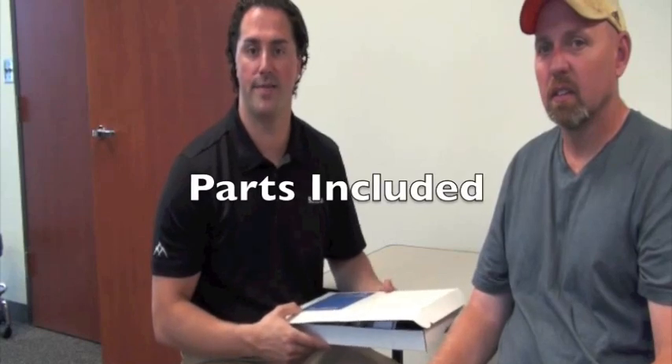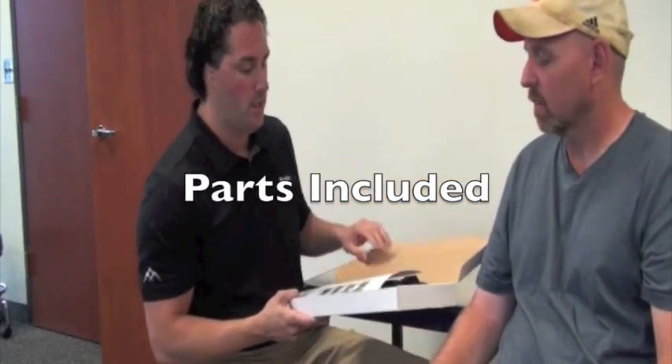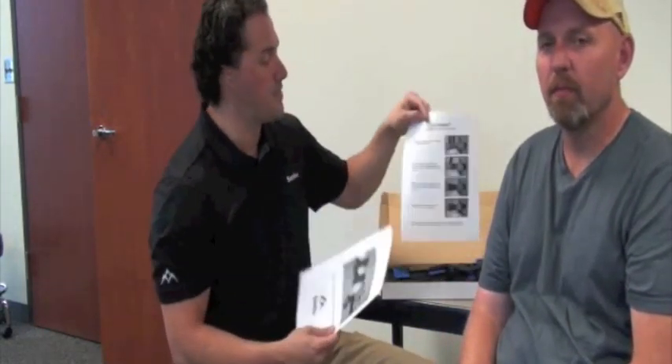When your Sabo Stretch arrives, it'll come to you flat in a box. You'll notice there's a Sabo Stretch manual for you to review on the proper fitting of the device. You'll also notice there's a Sabo Stretch quick fitting guide, which is a step-by-step guide on how to quickly put the device on.